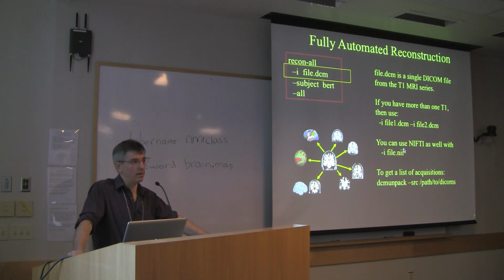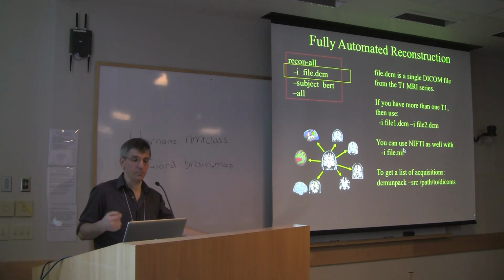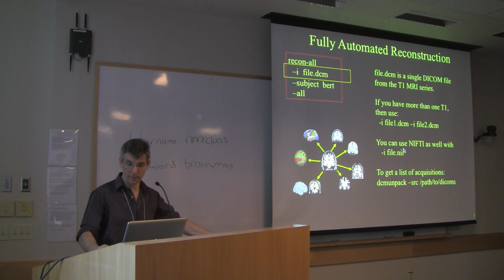It's best if you start with DICOM because we know that all the information about, say, which side is left and which side is right is correct in the DICOM. And of course, when you're doing brain image analysis, you want to make sure that you know which side is left and you know which side is right. NIfTI has that information in it as well, assuming that it was transferred correctly from the DICOM into the NIfTI. We really recommend that you not use Analyze format because that left-right information is not natively inside of Analyze.